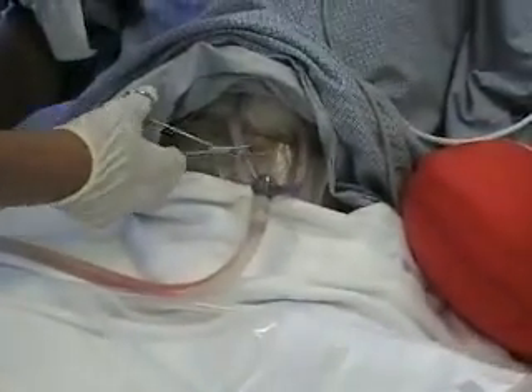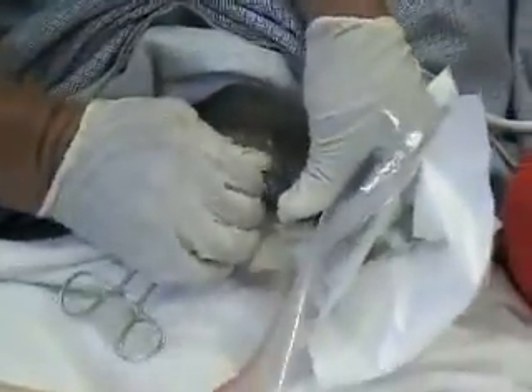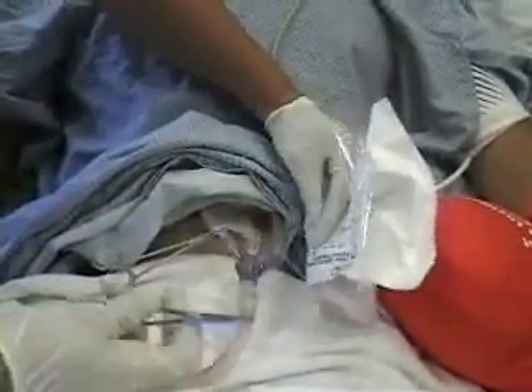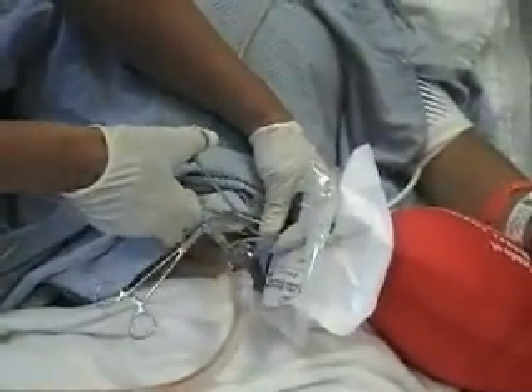And as I do that, I don't want air to enter into the space, so I tape this here, and I'm going to clamp. I'm taping right now. I'm going to clamp right above where I'm going, just a little bit of pressure, simply without touching the inside, mind you, and not pulling on the patient, mind you. I'm actually going to use two clamps just momentarily so that I don't get air backed up in here, as this is exposed to air — we don't want it going back in the other tube.